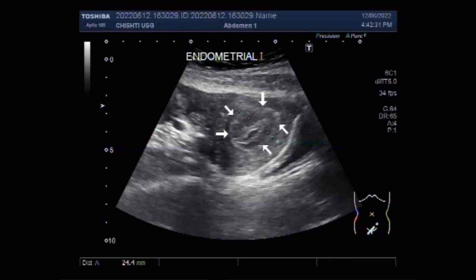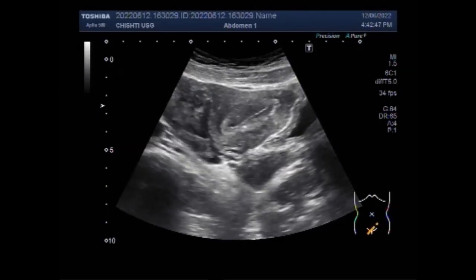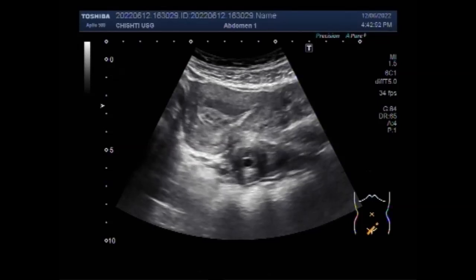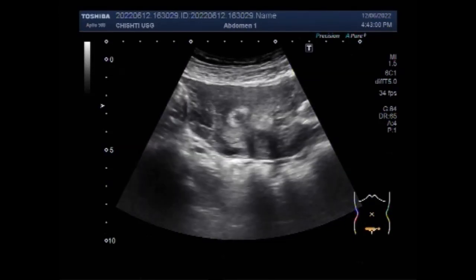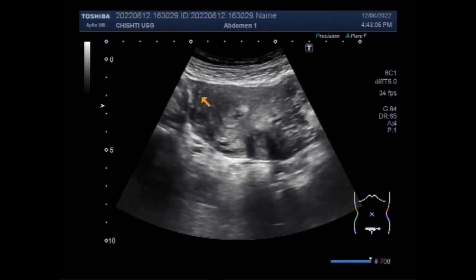Ectopic pregnancy is diagnosed when the gestation sac with the live fetal pole or yolk sac is found outside the empty uterine cavity. Sometimes diagnosis can be challenging if the ectopic pregnancy is in its early stage, as you are seeing in this case, and the sac is not yet visible by ultrasound. But in this case, a small gestation sac having a small yolk sac is visible.